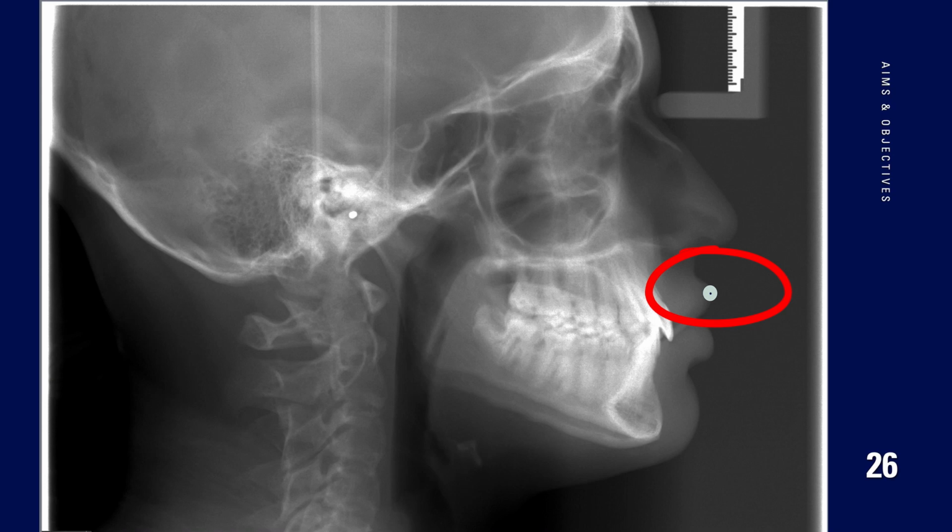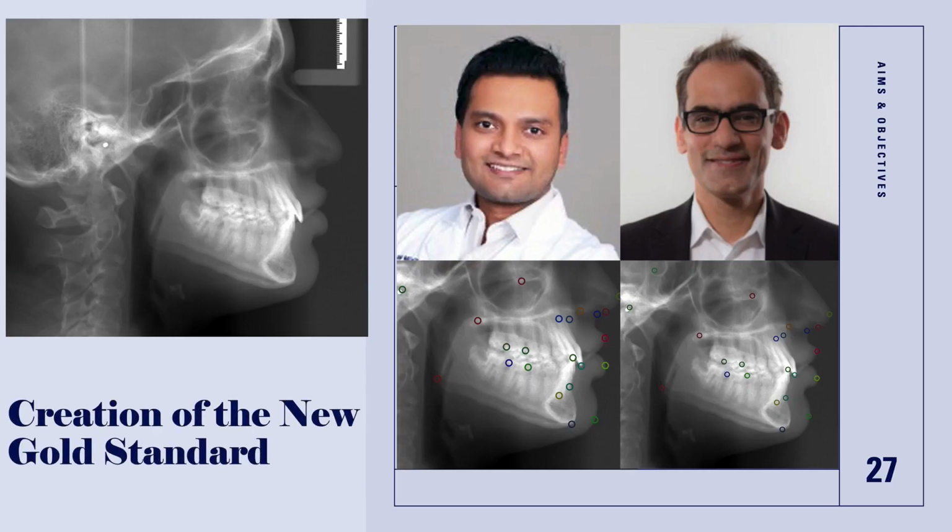For this reason, several researchers have claimed this measure of success could be too lenient and have begun using a 1 millimeter radius as their definition of accurate instead of 2 millimeters. But again, there is no basis for claiming this is a clinically accurate level either. Therefore, we would like to establish a new gold standard for inter-expert variability, which can be used as a new standard for success for each landmark.